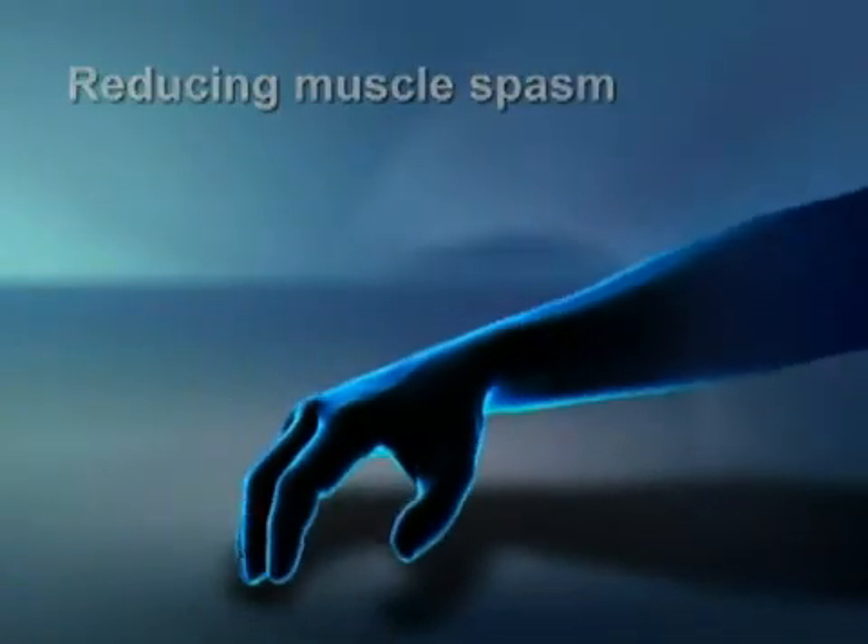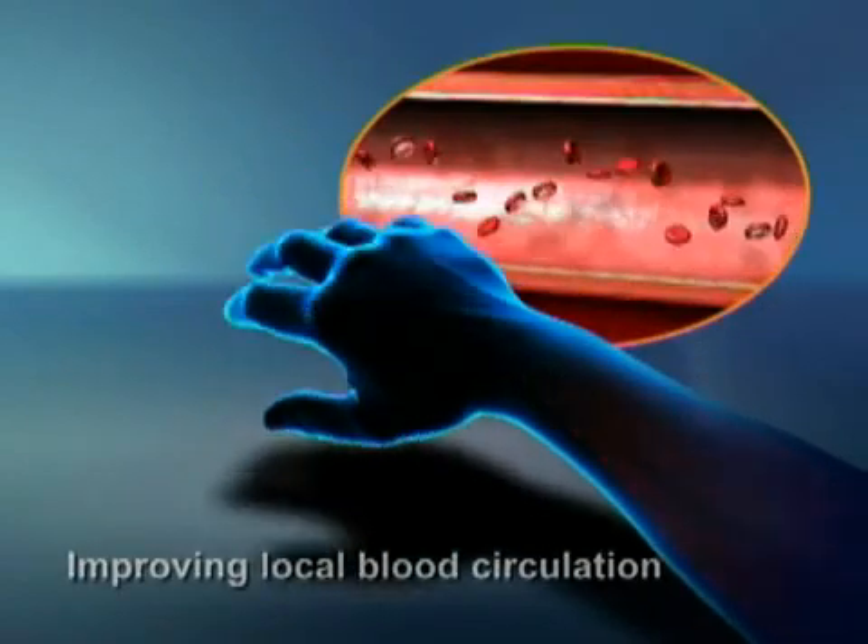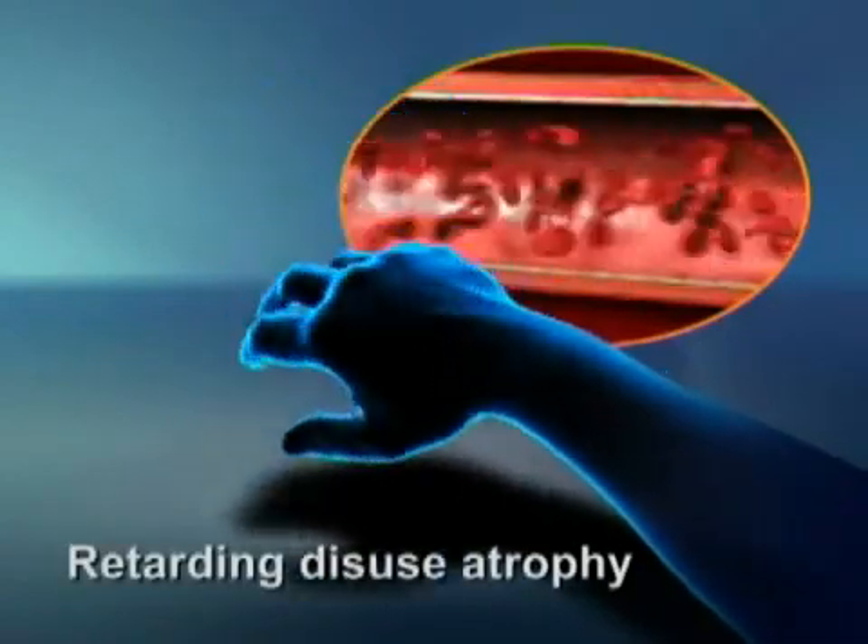Other possible benefits include reducing muscle spasm, increasing or maintaining range of motion, improving local blood circulation, and retarding disuse atrophy.